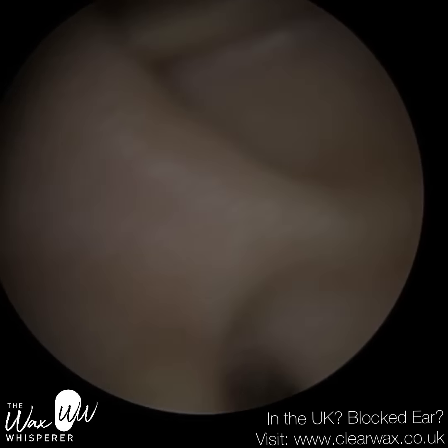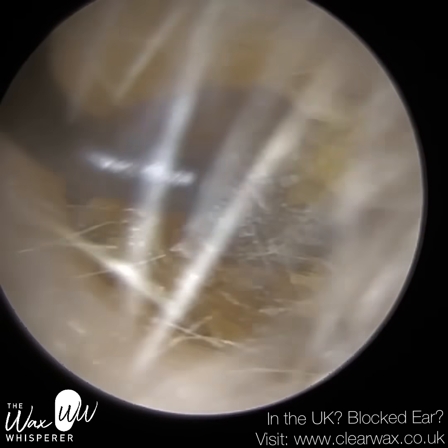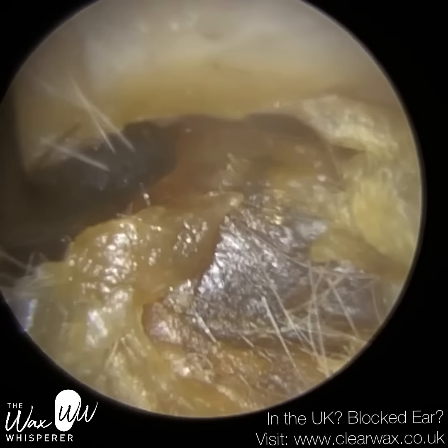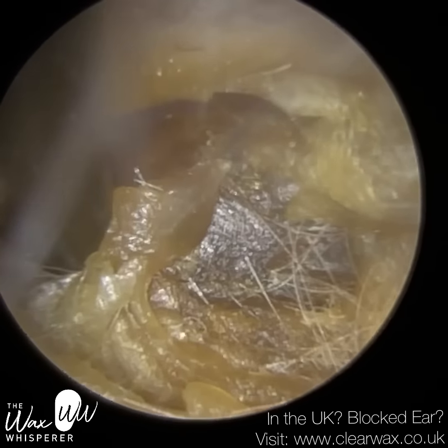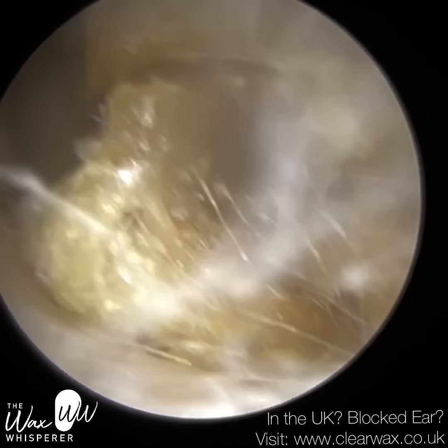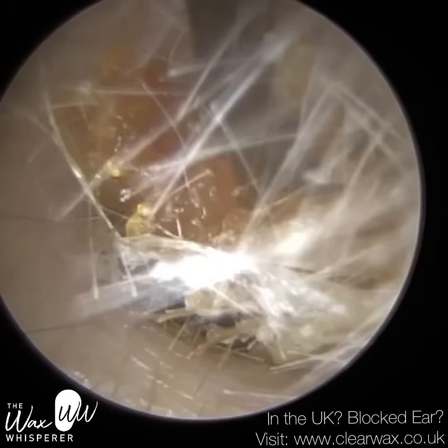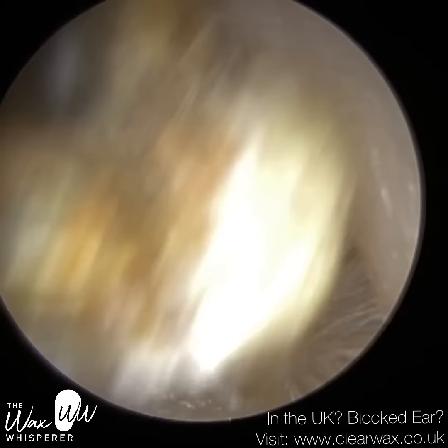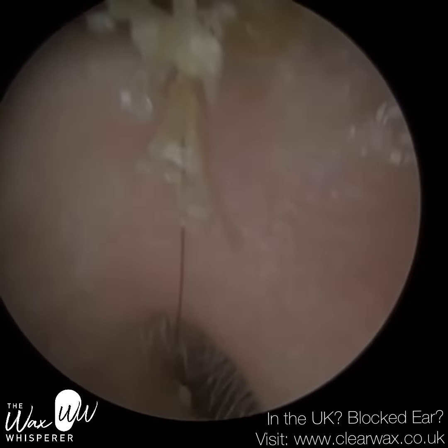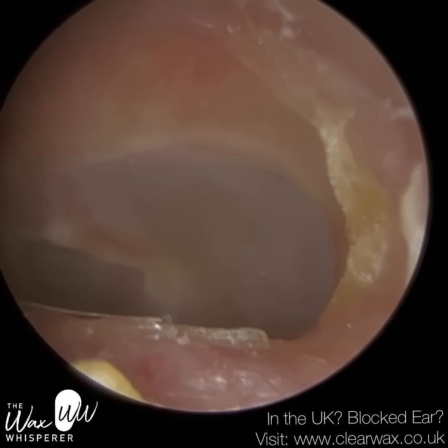I have a compilation video here of a collection of procedures performed using either an ear hook and or crocodile forceps. Ironically, all these patients attended today with really dry earwax or keratin that wasn't really suitable for microsuction, so using a standard Zollner suction probe. When you've got very dry, crusted earwax and dead skin like this, it's very difficult to get a suction grip.